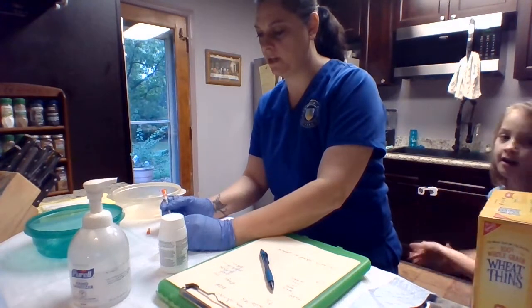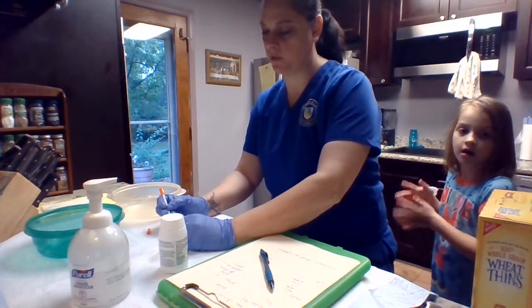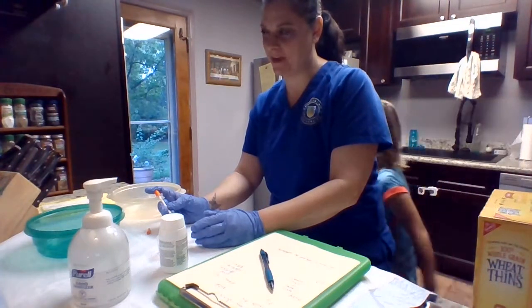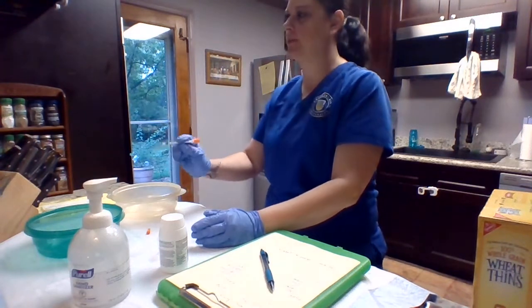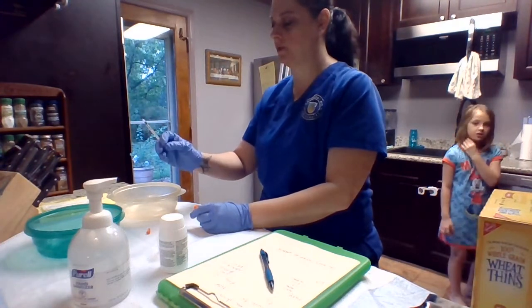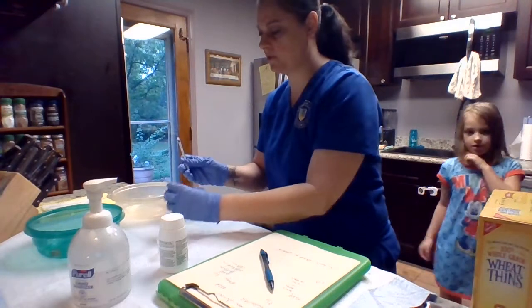to insert my needle. I am going to release the skin, and I am going to inject my medicine into the site. Then I'm going to remove the needle. I am going to put the safety device on.